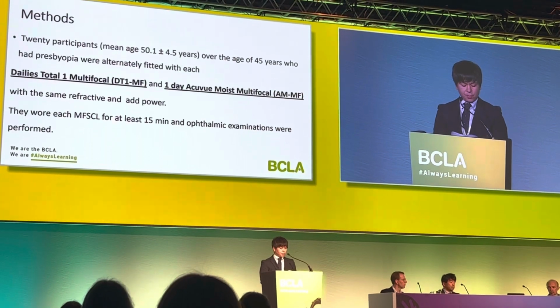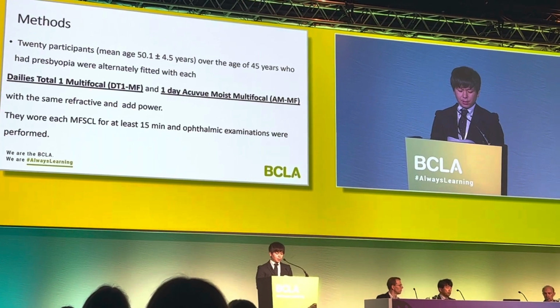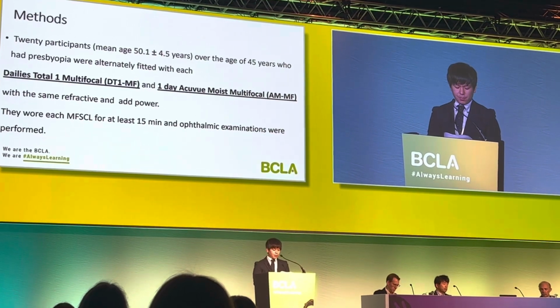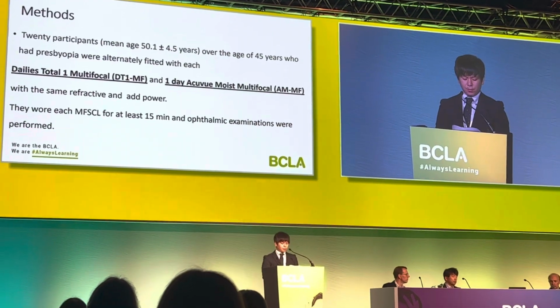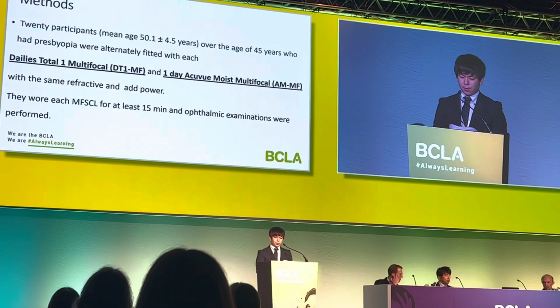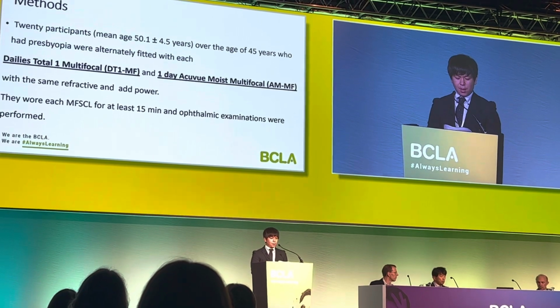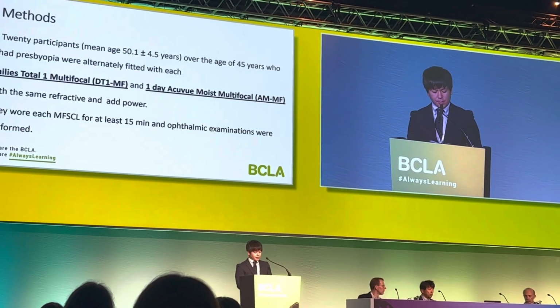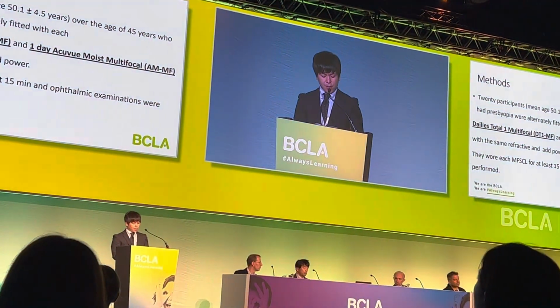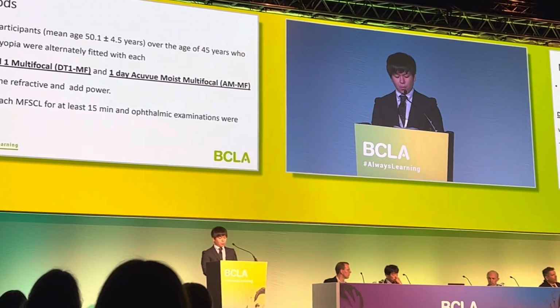Methods. 20 participants, mean age 50.1 plus or minus 4.5 years, over the age of 45 years who had presbyopia, were alternately fitted with Dailies Total 1 Multifocal (DT1MF) and 1-Day Acuvue Moist Multifocal (AMMF) with the same refractive power. They wore each MF-SCL for at least 15 minutes and ophthalmic examinations were performed.